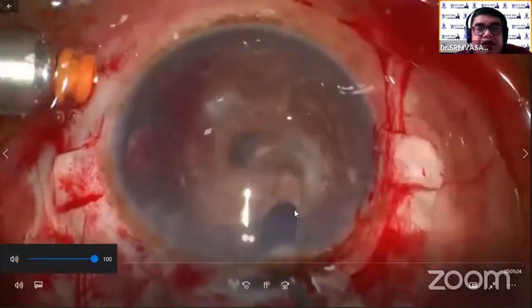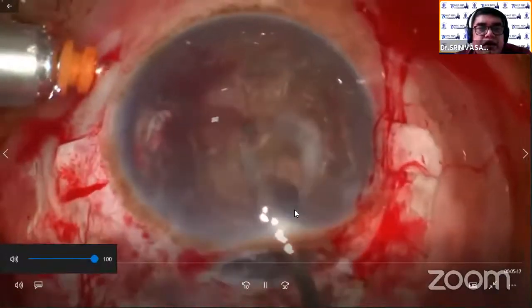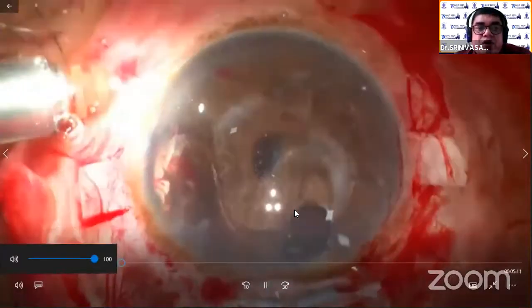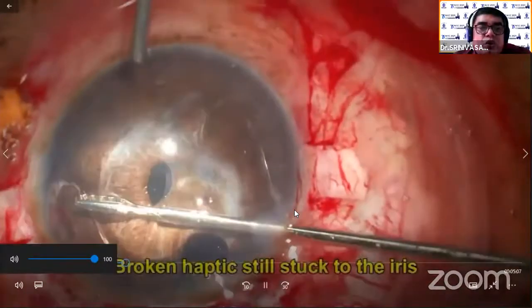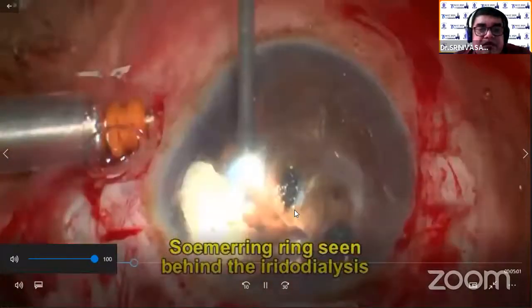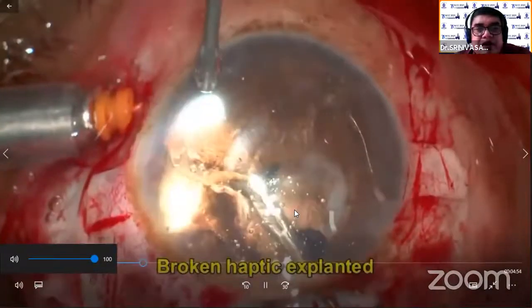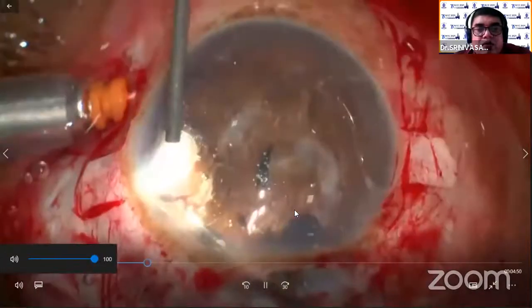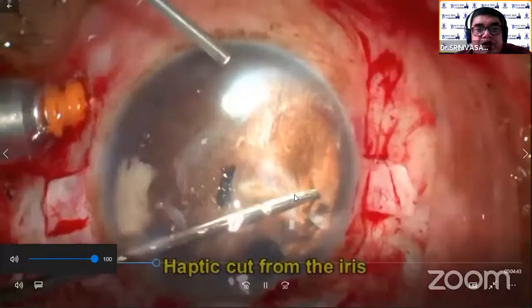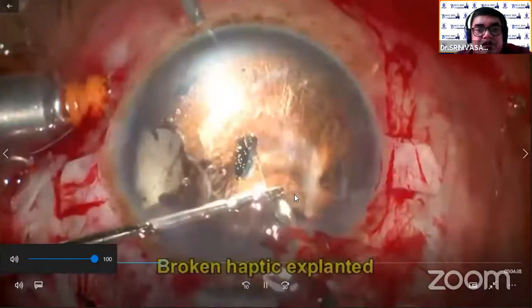So I cut the haptic at one end and I'm trying to remove the whole anterior chamber intraocular lens through the main port. You can see both the haptics and both the ends are stuck there. I had already created an iridodialysis at one end, and continuous irrigation fluid is there. We are doing an anterior vitrectomy — triamcinolone acetonide is definitely something I advocate to be used while doing this. Trying to rotate the haptic and take it out, and though I damaged a part of the iris with iridodialysis there, we cut the iris part and the piece of the broken haptic is explanted out. On the other side also, the haptic is stuck. Slowly trying to maneuver it — cut the adhesions with micro scissors and bring it through the main port.